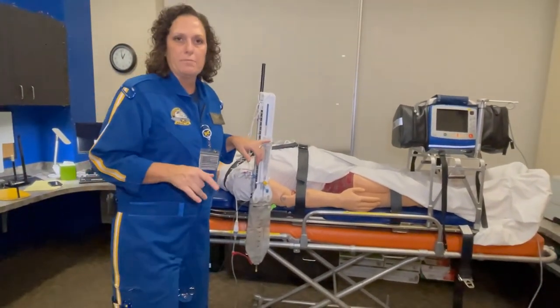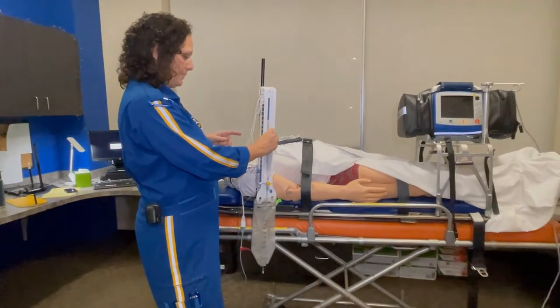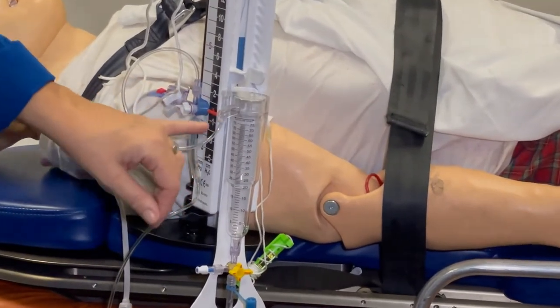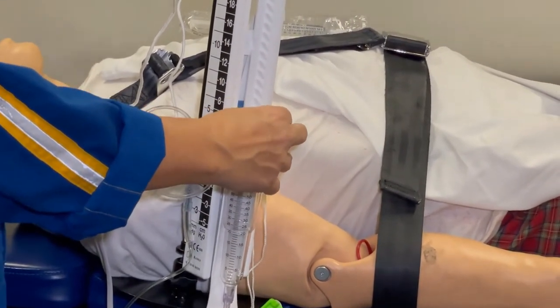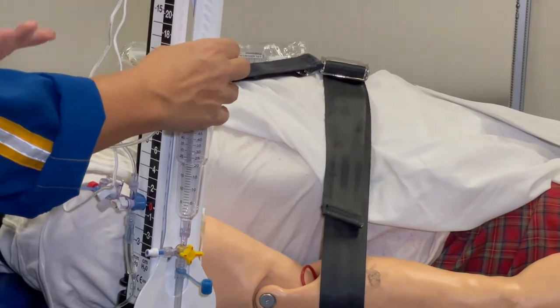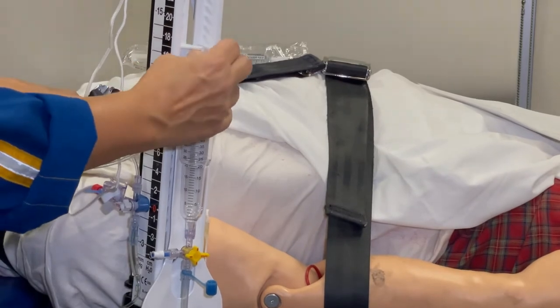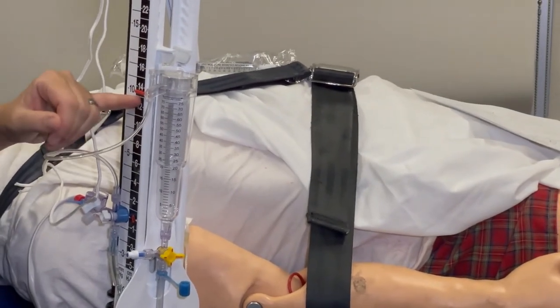If it won't zero, you can assume the membrane is wet, but you can still estimate ICP. Drop your buretrol to zero — the system is designed to therapeutically drain CSF for any ICP higher than the buretrol level, so at zero, if not occluded, you should drain CSF. Then march your buretrol up one or two centimeters of water at a time and note where the CSF dripping stops — that's your estimated ICP. For example, if at 12 you still have dripping, ICP is higher than 12. If you go to 13 and it stops, estimated ICP is somewhere between 12 and 13.